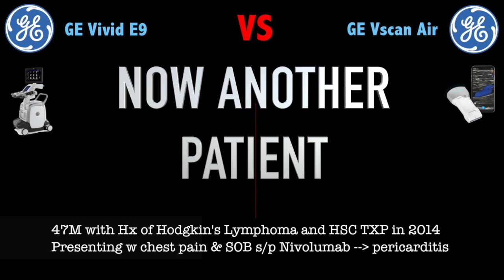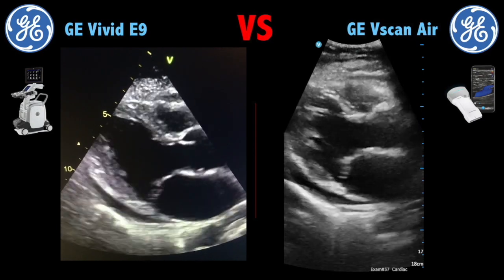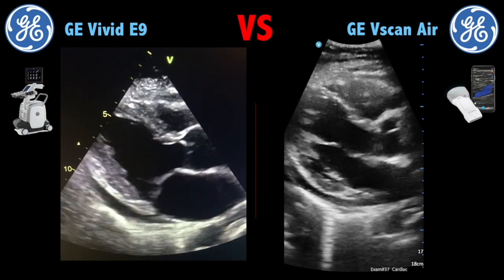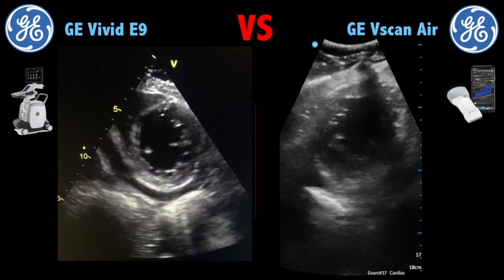Now let's go to another patient, which was a young male with pericarditis. Here you can see the parasternal long axis, and you can see the black line below the heart, meaning free fluid — that's the pericardial effusion. This is a low parasternal short axis, again seeing the papillary muscles.